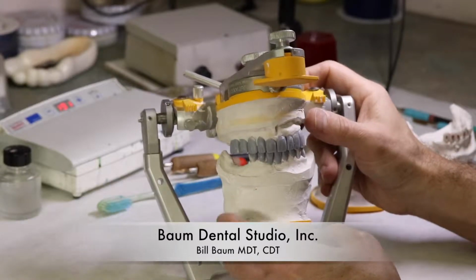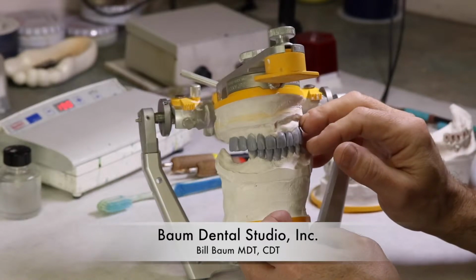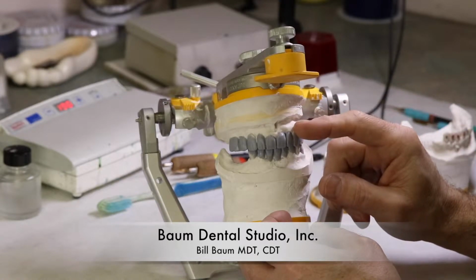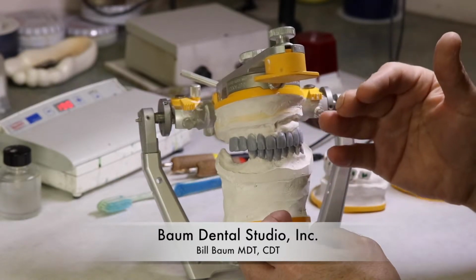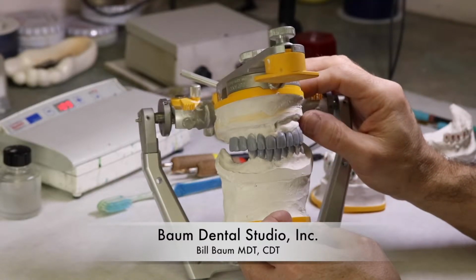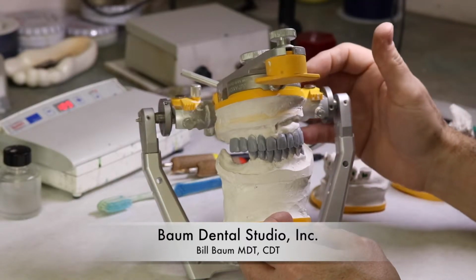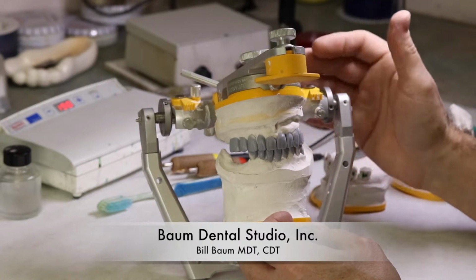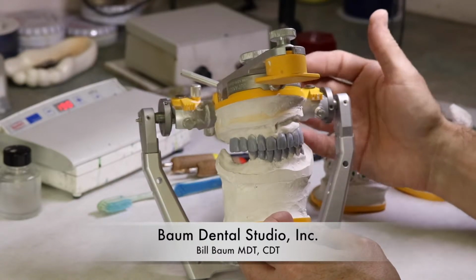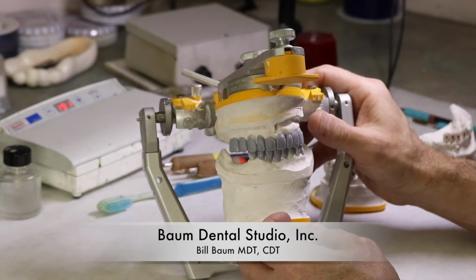So the next phase is to duplicate these casts, cross-mount the duplicate to this wax up, and one of two things could happen. Either the dentist will use that duplicate, and I could make him matrices to build provisionals intraorally directly on the teeth, or I could make lab manufactured provisionals, which is where this dentist would like to go.